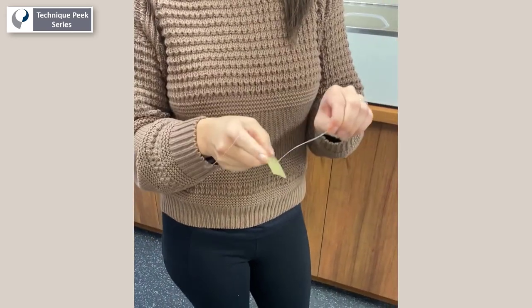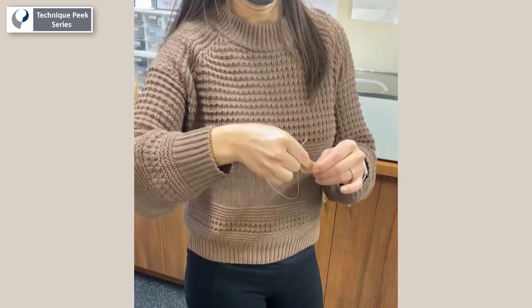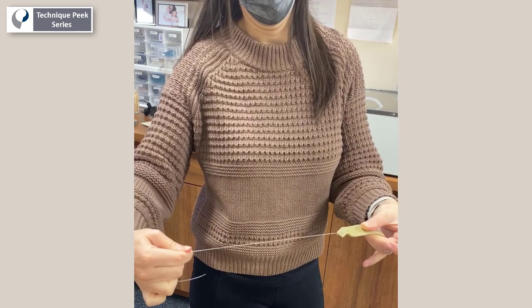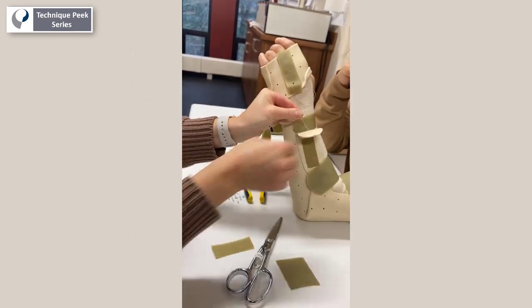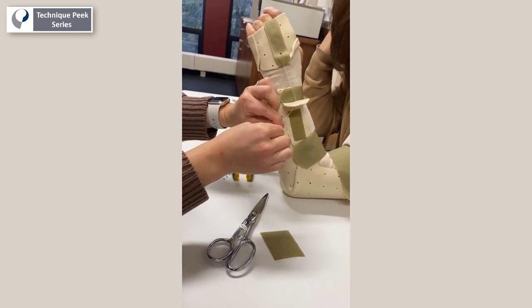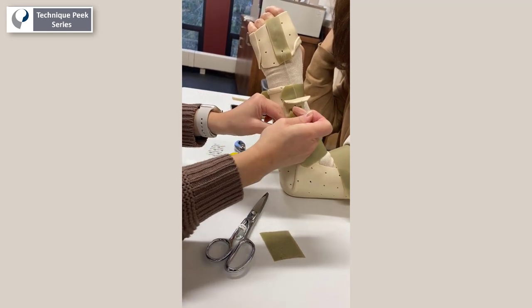For the strap component, take a piece of fishing wire and double it with the velcro as shown. Before attaching the final piece of velcro, you will need to guide the fishing wire through the wing, then attach the velcro piece to complete the dynamic component of the splint.